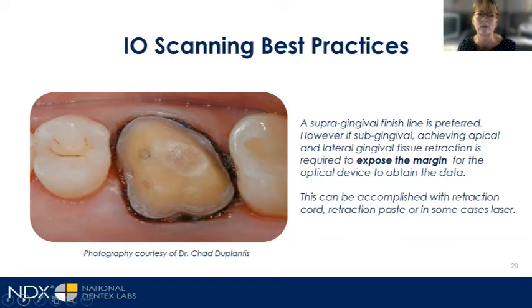This is an image that I really like. Dr. Duplantis provided this to us, and it's ideal, right? So the gingival tissue has been properly retracted away from the prep, and it's exposing the margin, the finish line.